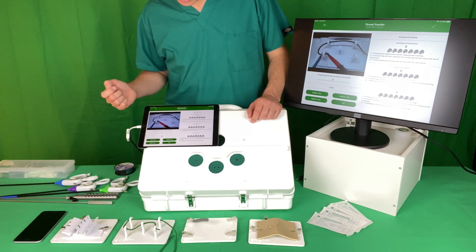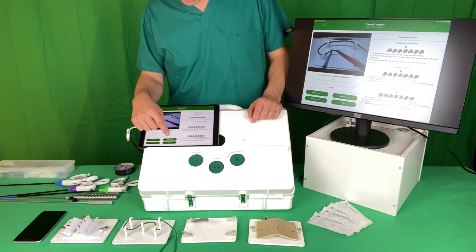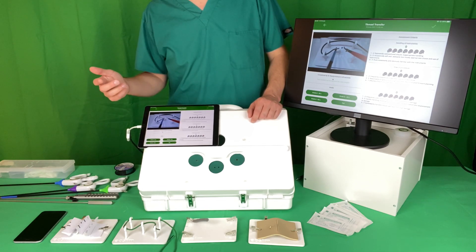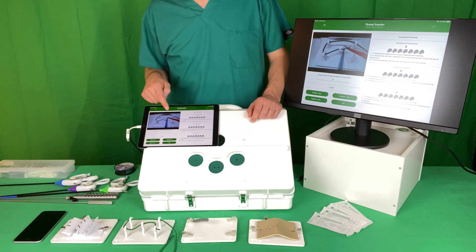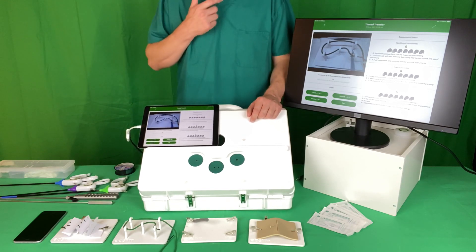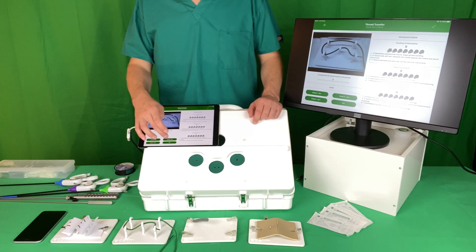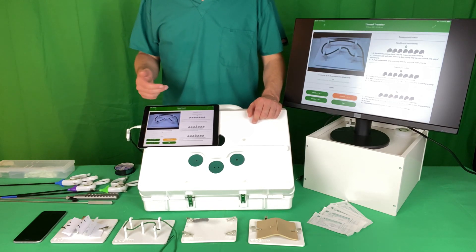In this case the task was done in 29 seconds, so they don't quite meet the 25-second threshold for grade A, but they're underneath the grade B 45-second threshold, so you click grade B. You have to watch the video to make sure that they did actually complete the task, and then you click grade B.